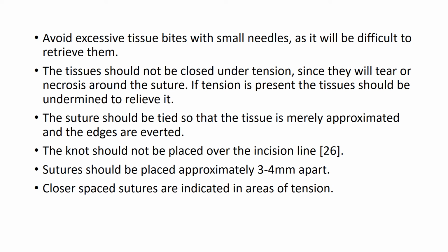The other thing that we have to remember is that we should avoid excessive tissue bites with small needles, as it will be difficult to retrieve them. The next thing to remember is that the tissue should not be closed under tension, since it will tear or necrose around the suture. If tension is present, the tissue should be undermined to relieve it.